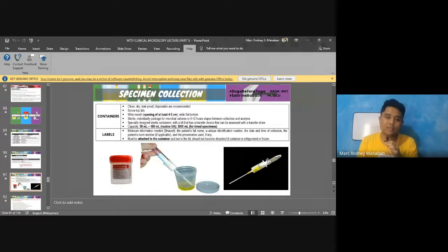Depende sa inyong protocol. So, always follow your laboratory's protocol, the institutional protocols. Alright? Ayaw mo pagbuot. Okay? Kung ano silang giingon na dapat na dito sa label mo, mo i-follow. Alright? Especially ka ng mga preservatives na gigamit dears, especially if mo send out mo og mga specimens. Meaning, magpadala mo specimens og lahi na laboratory kay wala mo ani na reagent, dili mo ka-process ID, you have to make sure na i-specify siya sa request form or sa asa magani na nagamit kag preservative para at least ang receiving laboratory makaget sila na, okay, this specimen has this preservative. So mag-expect na sila kung sa mga possible implications that would bring, kaya na may preservative. Alright?